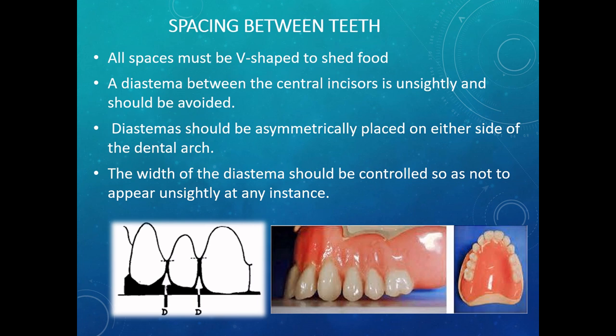Similarly, spaces are placed between the posterior teeth as additional spillways for food, and also it creates additional cutting edges formed from the marginal ridges. And grinding the proximal surfaces of the posterior teeth can sharpen these cutting edges of the marginal ridges.